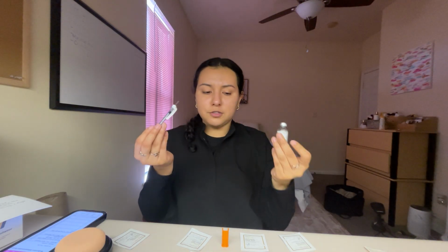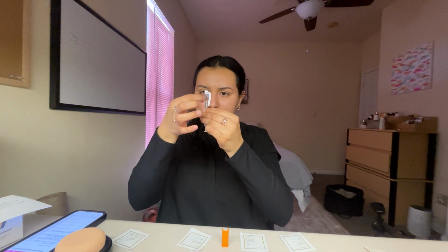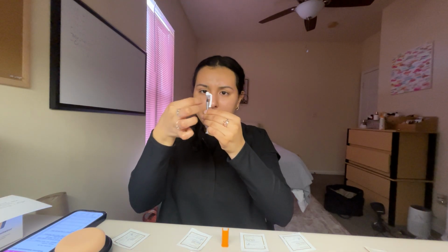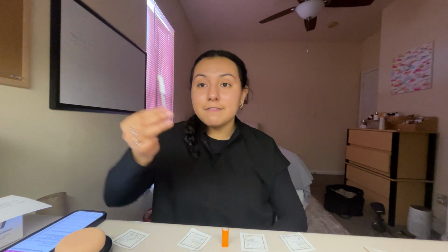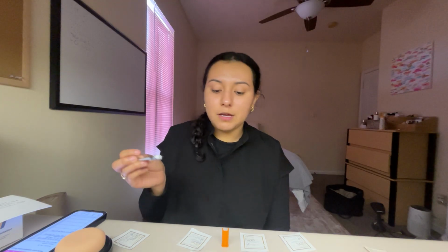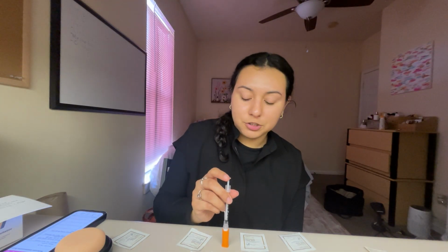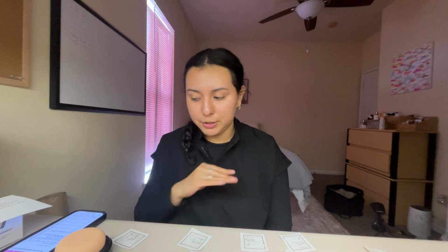And I'm going to remove the syringe and needle. I had a couple of bubbles, so I overflowed a little bit, but okay, we have 6 units, and now I'm going to cap it with one hand, and I'm going to place that aside for my MAR check number 2.